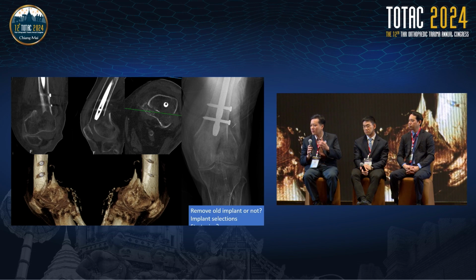It has quite robust screw holes at the distal fixation and a little more proximally if you want very secure fixation. But from Synthes, I think there's no medial plate invented yet. No, not in our market.